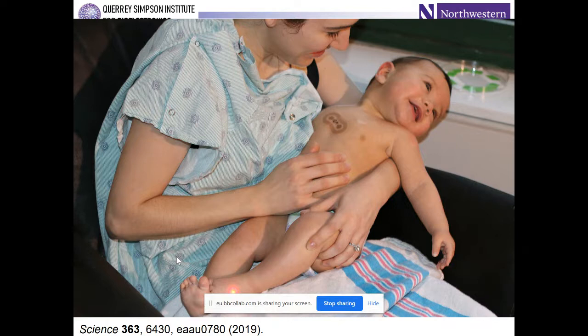And so in this case as well, eliminating the wires has a lot of value. In this case is a picture of a mom interacting with her baby. You see the device on the chest. I talked about that one. The blood oximetry device is mounted on the foot. In this case, the wireless transmission and receive antenna is mounted in the base of the chair.